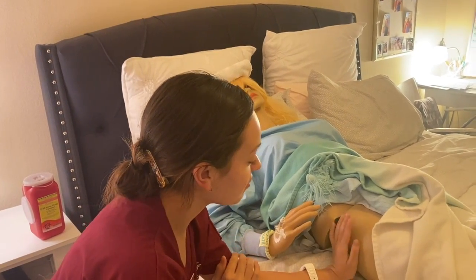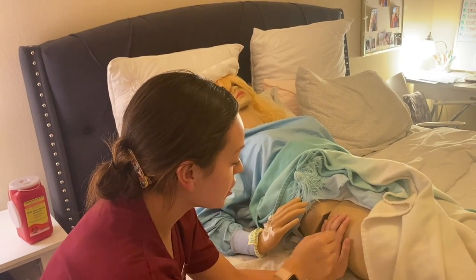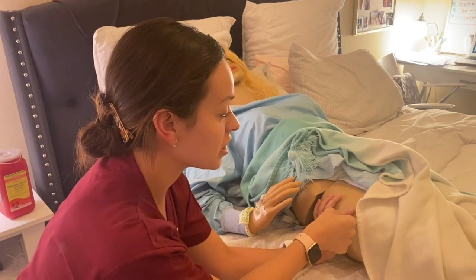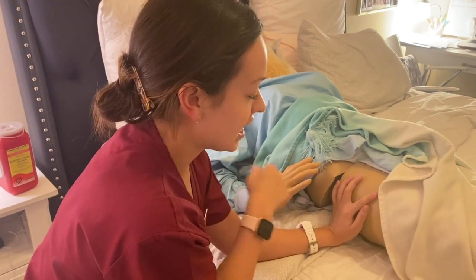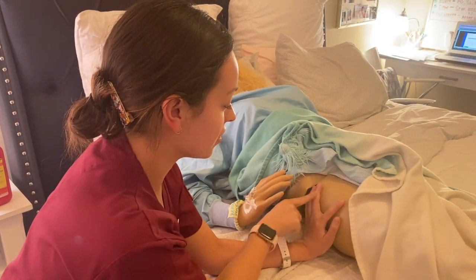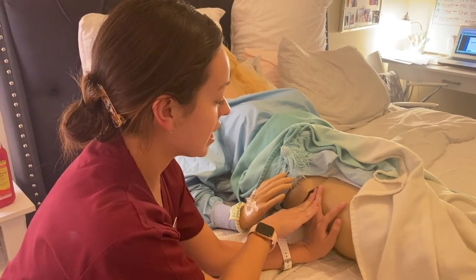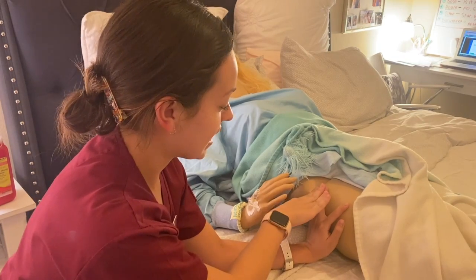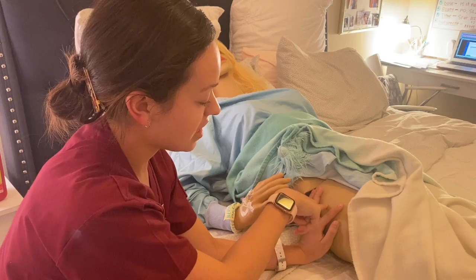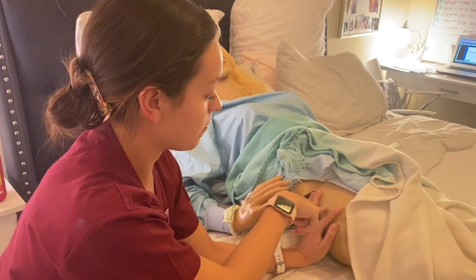So I would put it around here, and then I'm going to move my index finger to the anterior superior iliac spine, and then I'm going to move my middle finger and the rest of my fingers and feel for the iliac crest, and then I would inject in between that at a 90-degree angle as well.